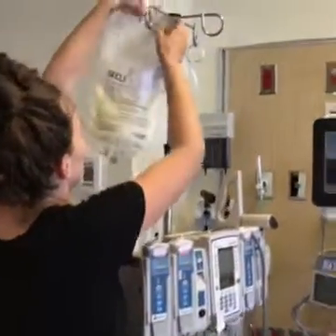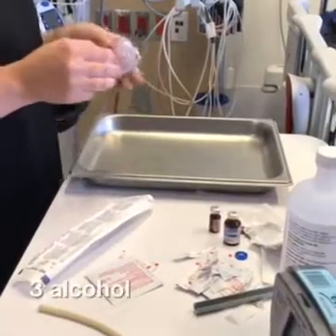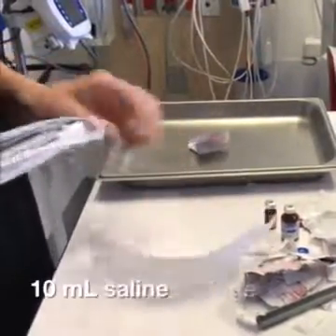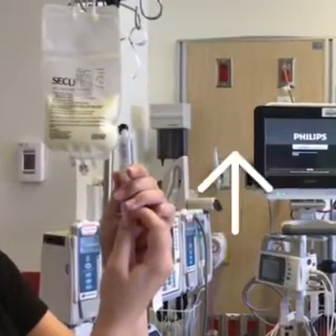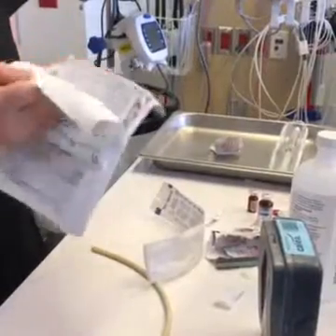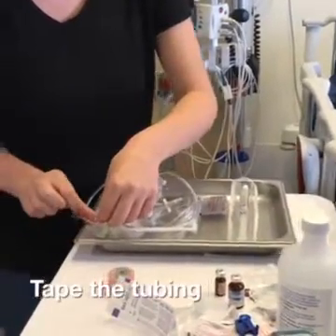Elevate the PN bag and clean your hands. Gather supplies for priming the tubing — you will need three alcohol swabs and a 10-milliliter saline syringe. Remove air from the syringe: first pull down on the plunger, then push the air out until a drop appears at the tip. Replace the cap and place it into the plastic boat.